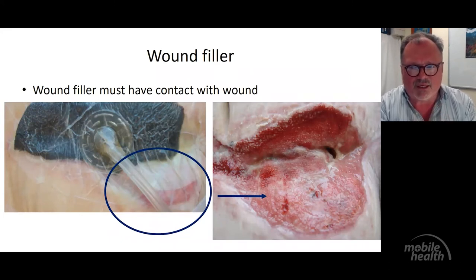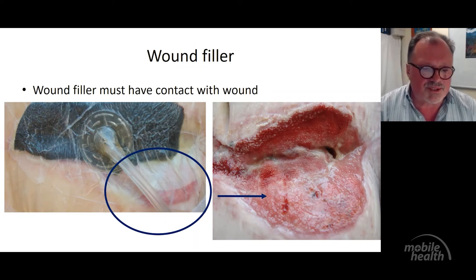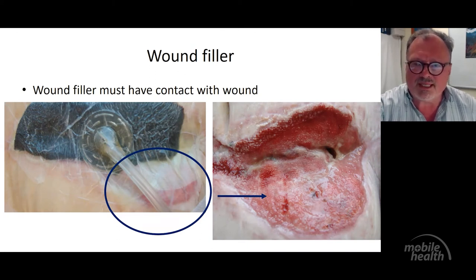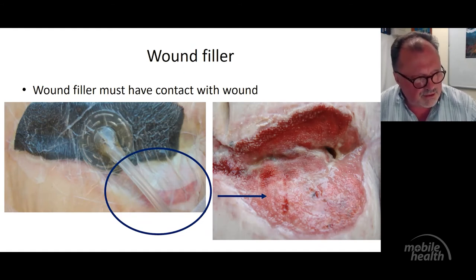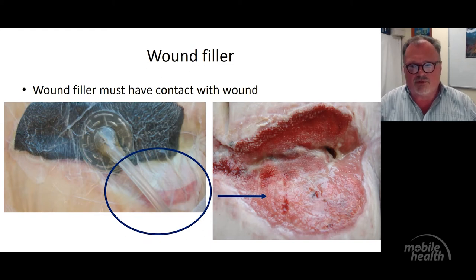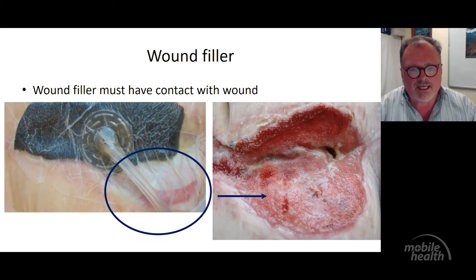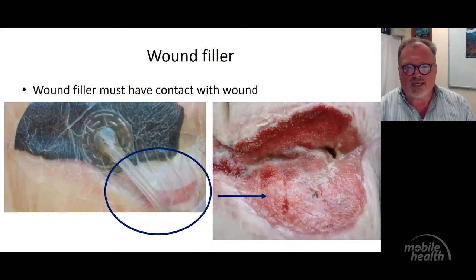So when you take the dressing off on the right side, you can see the shiny area here. That's where there was no negative pressure foam. It's a soupy mess, all right? It's a breeding ground for bacteria, and there's just nothing happening. It's unhealthy. Whereas in the rest of the wound, you can see how the foam creates this bright red granulation tissue, which is why I always say to colleagues when we teach, you can see how effective your negative pressure dressing is. You're using a system which costs you hundreds of dollars a week, so make sure that you get the best for your buck. If you assess that wound here, it wasn't effective, all right? So improve your technique.